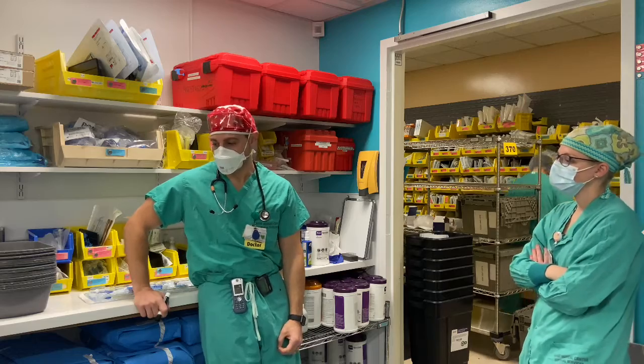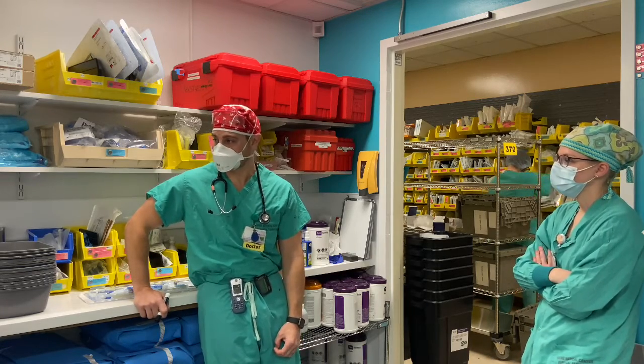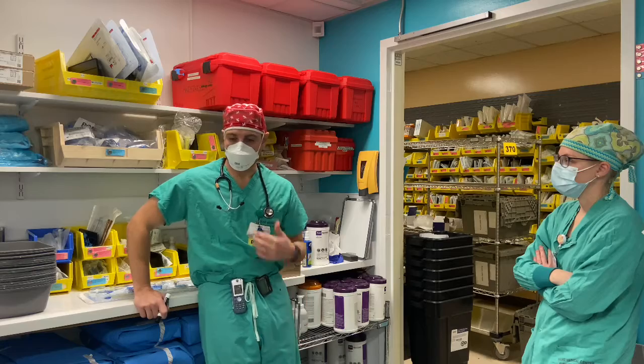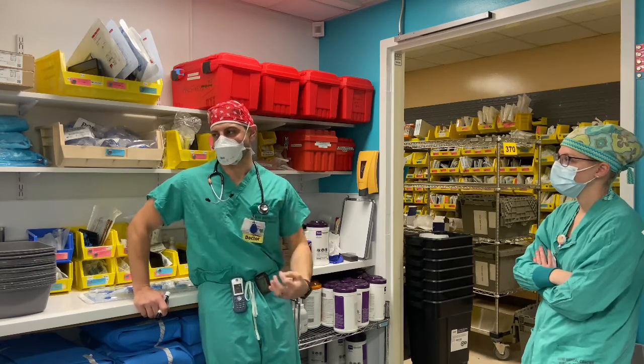I noticed in the cardiac rooms they use the ETT a lot. They probably don't use LMAs. We pretty much never use LMAs in cardiac with the exception of maybe a sternal wound debridement, where they're staying sort of superficial in the body. They're not going down into the chest.